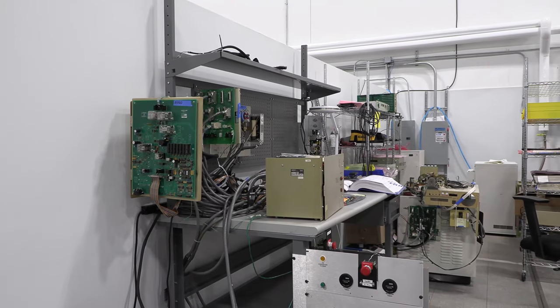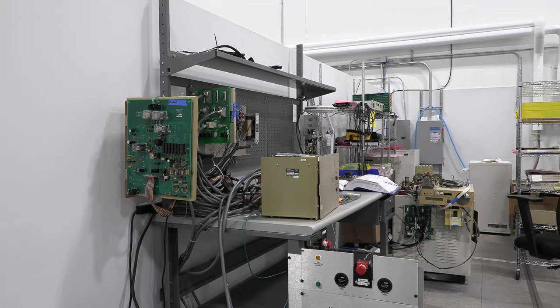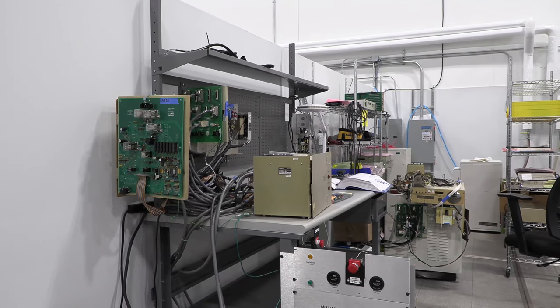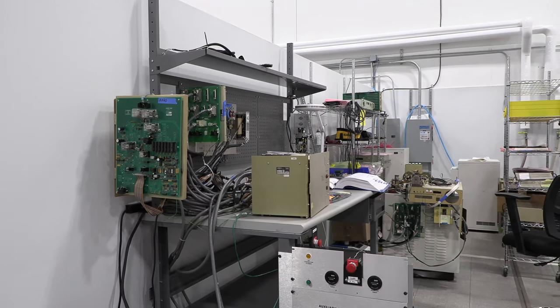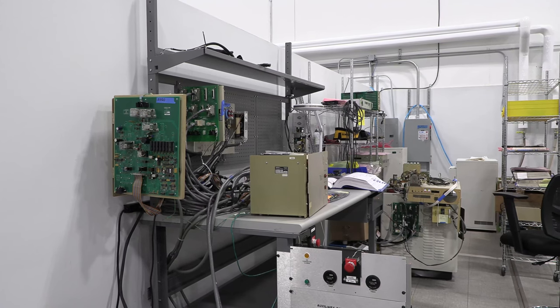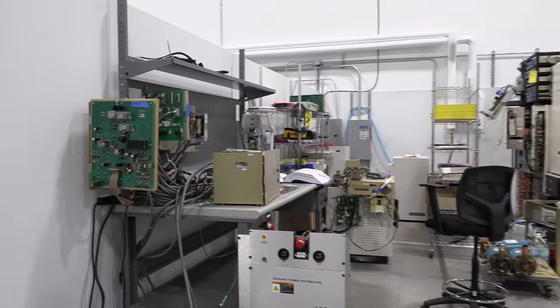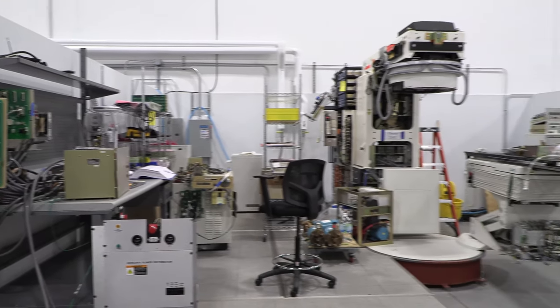One of our guys who's retired from the field put all this together, and he's working on it. He's got it about 50% done. So basically, if I want to test the motor, instead of putting it inside the machine, everything's external. I can hook it up externally and test it in 5 minutes versus an hour it might take to put it in the machine. Wow.